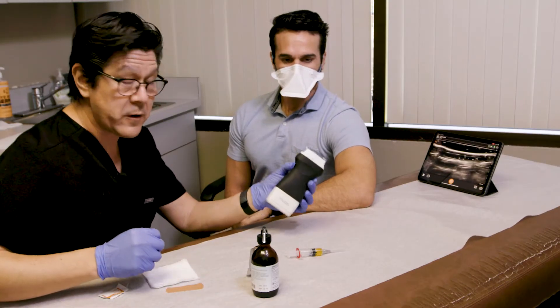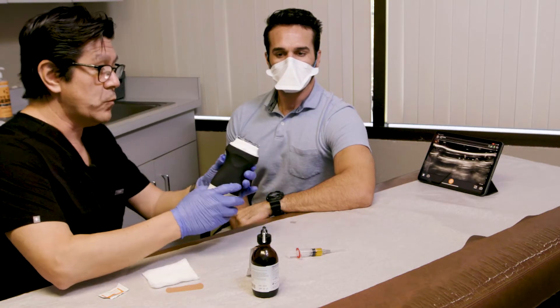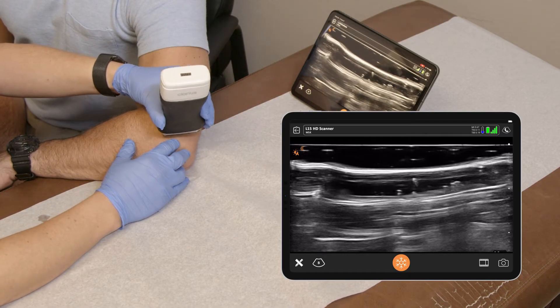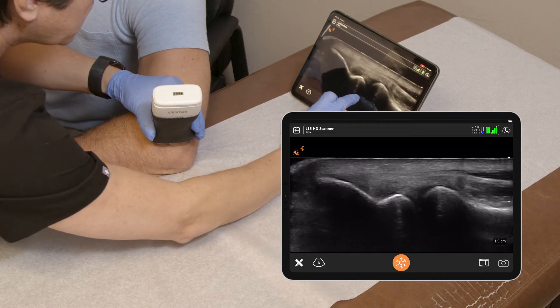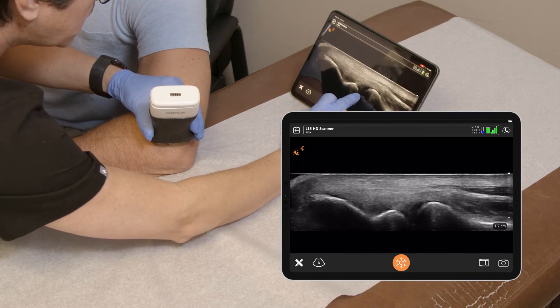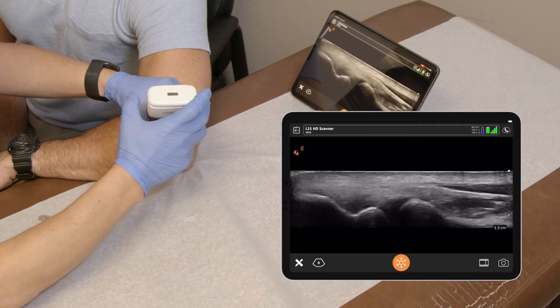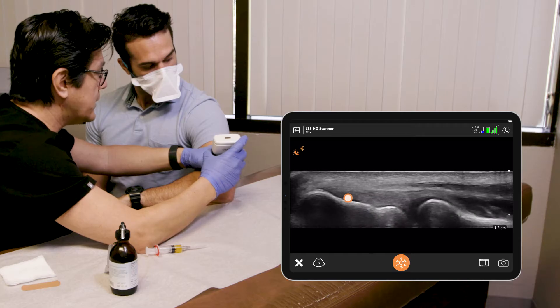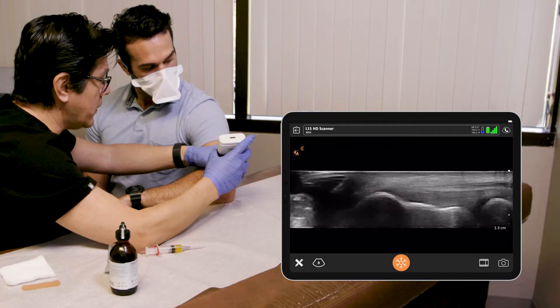I have my Clarius L15 — it's really good for looking at MSK. We can see very nicely the exact area we want here, the lateral epicondyle. It's got a little bit of a hypoechoic area to it, a little bit of signal change right in there, and that's exactly where we want to go.